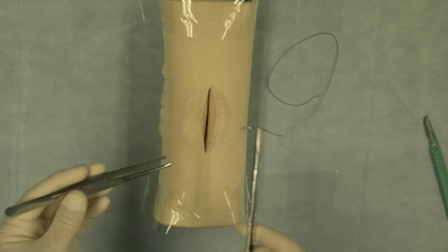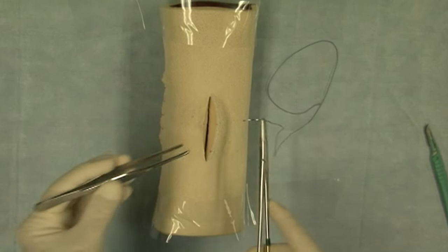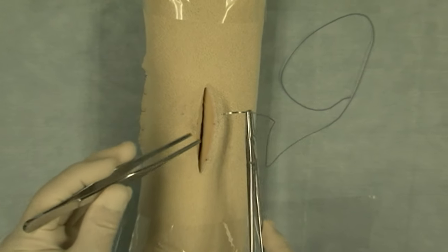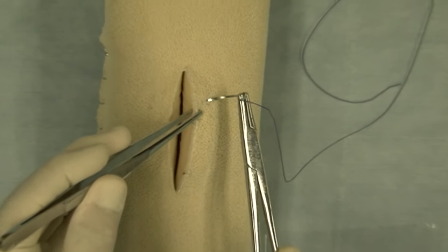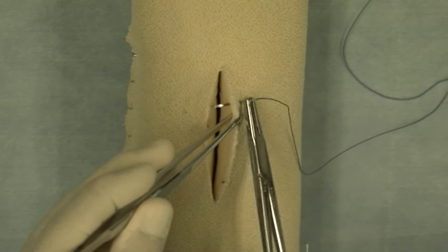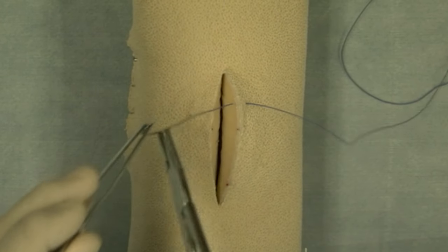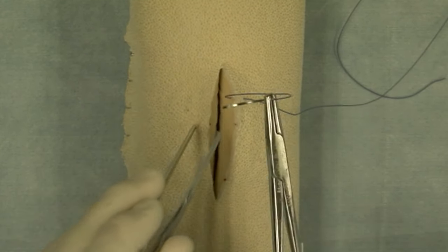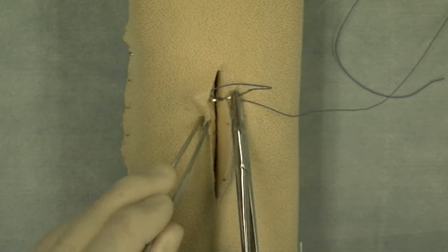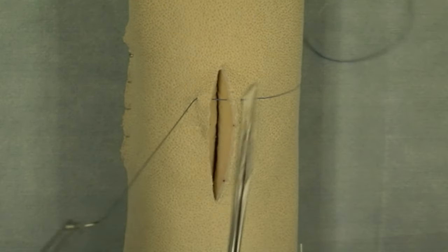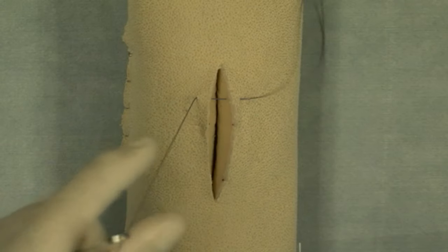We'll be demonstrating the cruciate suture pattern. This is an interrupted suture pattern. First part: bite on the near portion of the incision, far portion of the incision, reset my needle, pull my suture through.